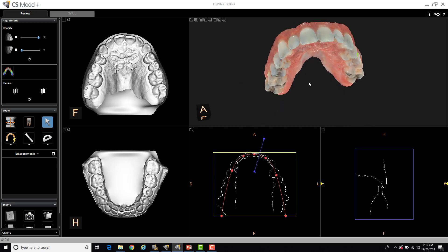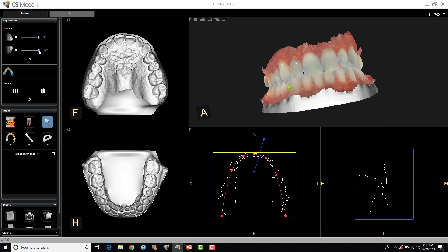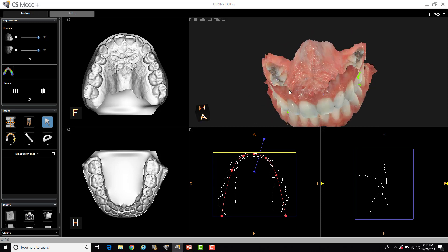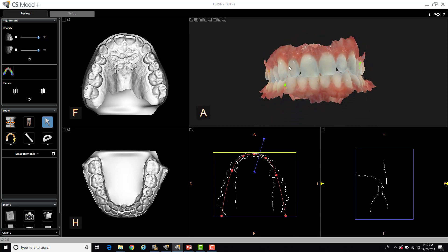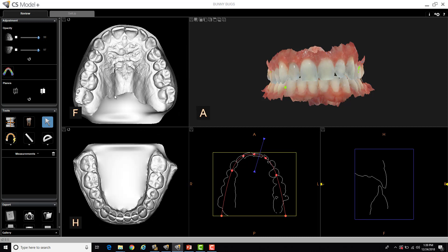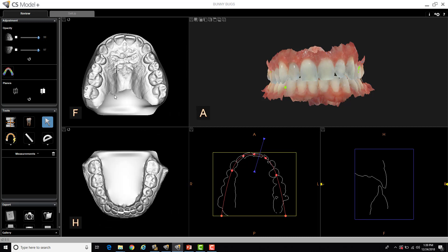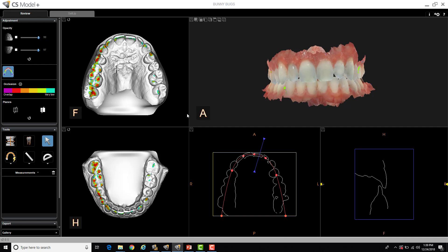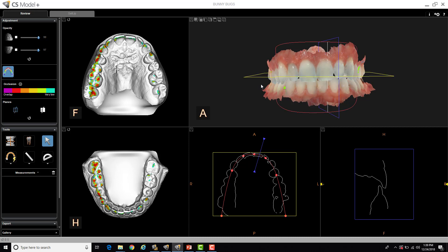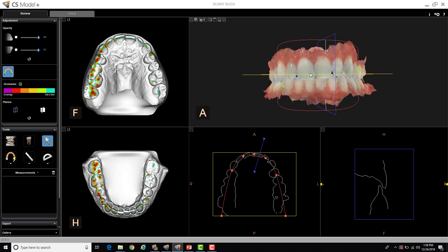So let's bring this back down and go back to where we were before. So I have my upper occlusal and my lower occlusal shots. I can zoom in and out of these, and this will display where the patient's teeth are occluding, based on the actual bite record. You'll also see here your cut planes, so you can actually see exactly where you are. So this yellow cut plane correlates to what I see here in my yellow box.